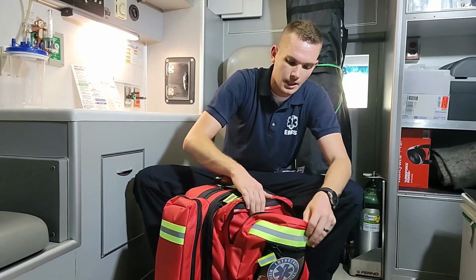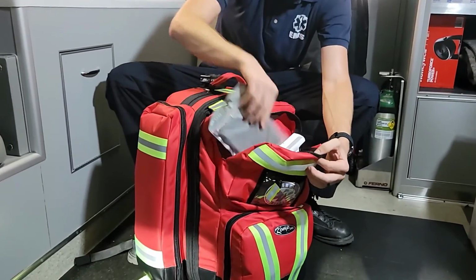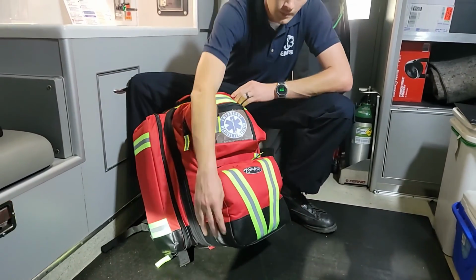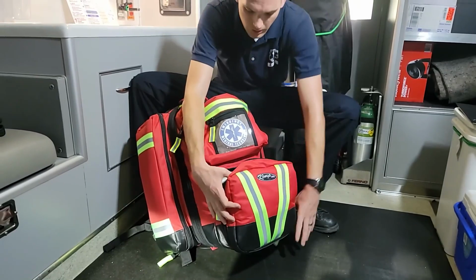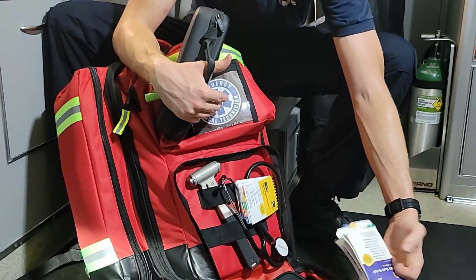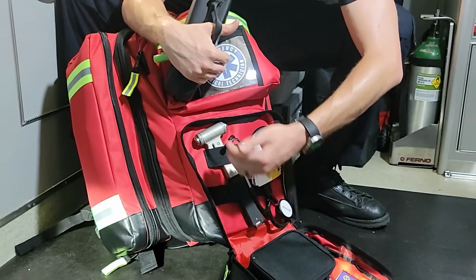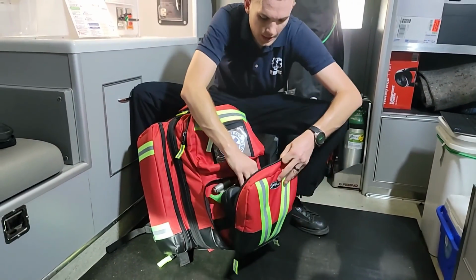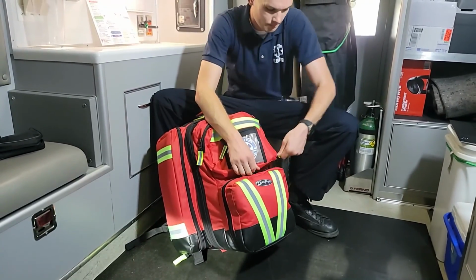And this top bag is where I put a lot of my snacks if you're working long shifts. Currently in here I've got a cooling towel and some wound wash, because that's where it works for me. Down here in this front compartment, this is where I have my vitals. I've got a blood pressure machine, ALS field guide, BLS field guide, stethoscope, a little emergency hammer thing for breaking out windows and cutting seat belts, pins, those types of items, quick grab things. You need them real quick, right up front.